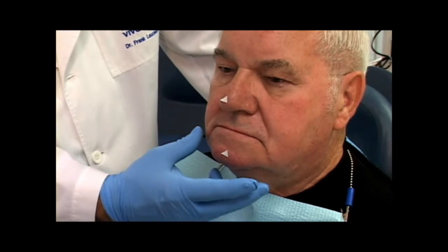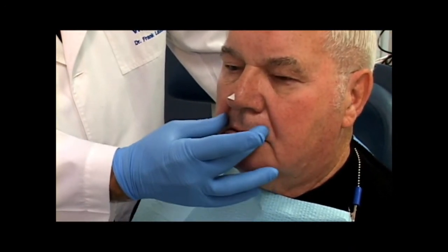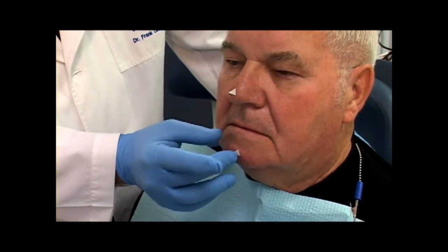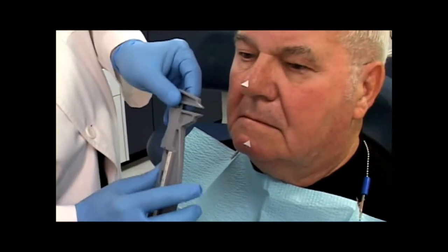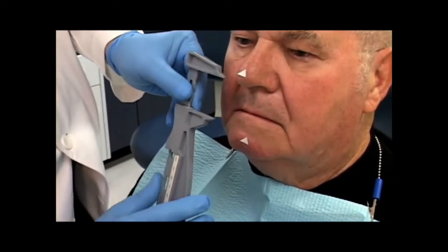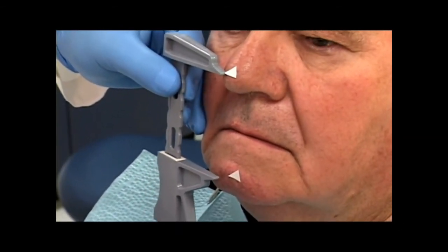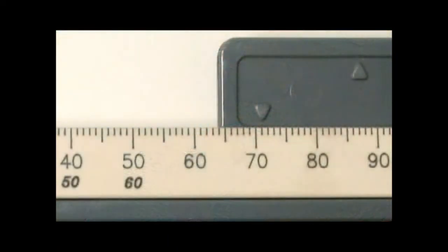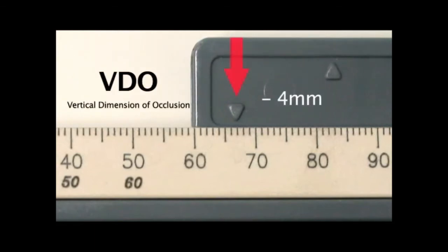However, it's still beneficial to leave the patient's denture in the mouth while assessing vertical dimension. They are encouraged to relax their facial muscles. Once it is certain that the patient is completely at rest, a measurement is made using the bite gauge. This measurement is considered the vertical dimension of rest. Four millimeters is subtracted from this measurement to approximate the vertical dimension of occlusion.